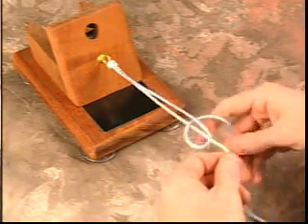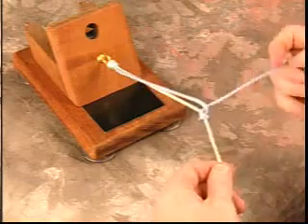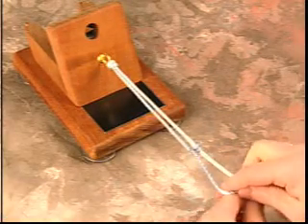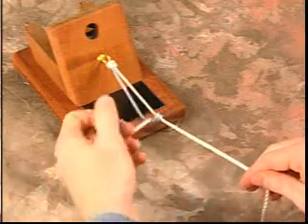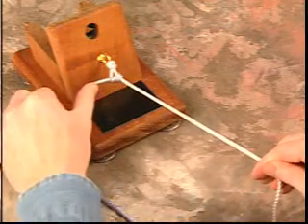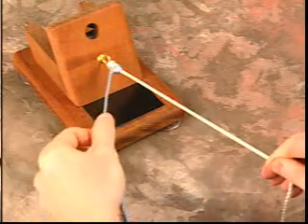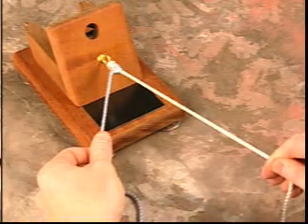Doing an overhand throw two times — a double surgeon's knot around your new post limb — this is then slid into the joint, past-pointing to secure the knot at this time.